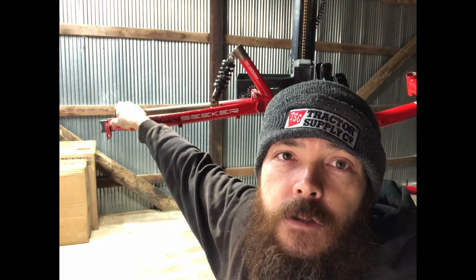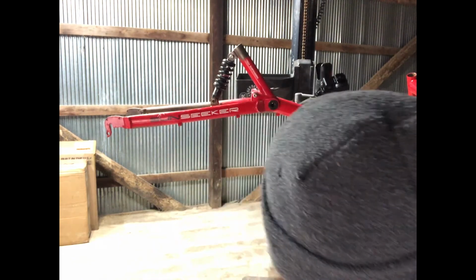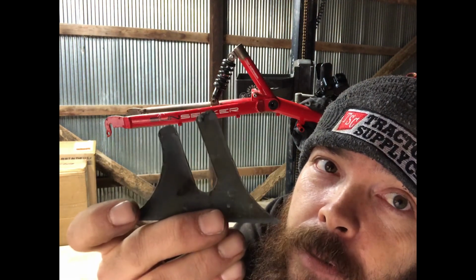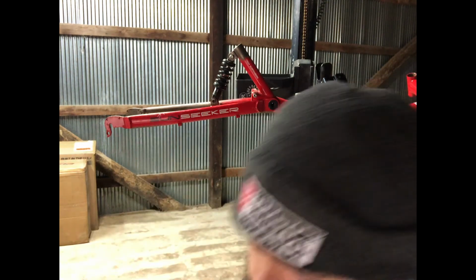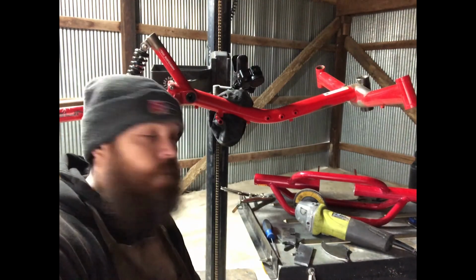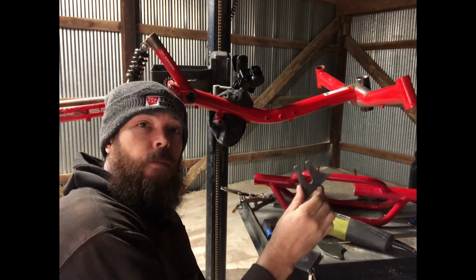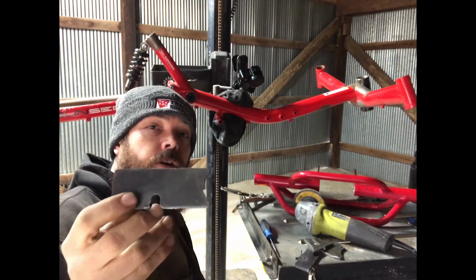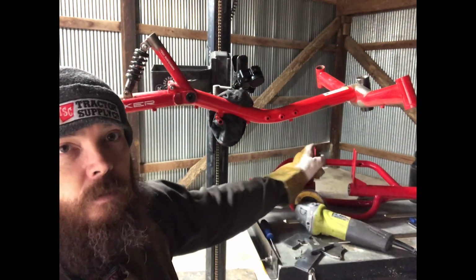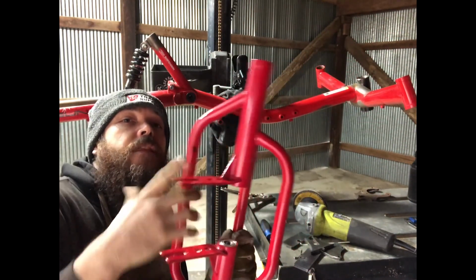Most of them have a bolt on, and they also have it slide in and out for some type of chain adjustment. But we've already fixed the chain adjustment by building our dropouts that look like this, that are cambered, so that the motor can slide up and back. We didn't need that, and we tension the chain as we need it. Now that I brought you all up to speed, we have our disc brake mount, we have our motor mounts, and now we have our rear cage mounts, which are going to allow us to connect the cage. So all I got left now is to do some grinding. I'm going to cut these tabs off right here. These ones right here, I'm going to go ahead and cut these off.